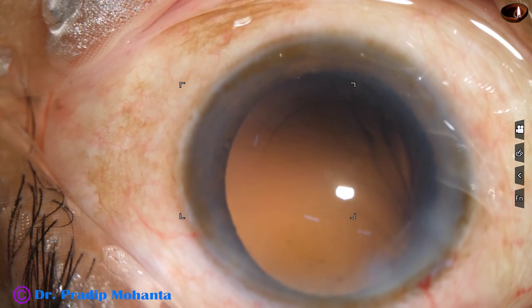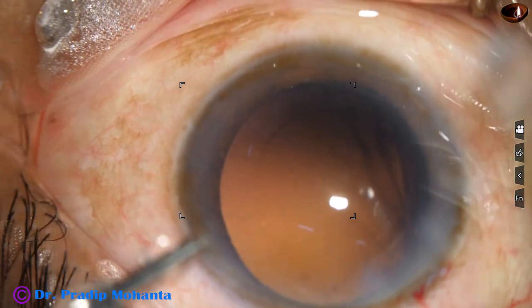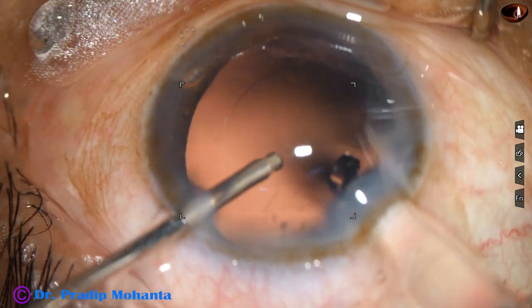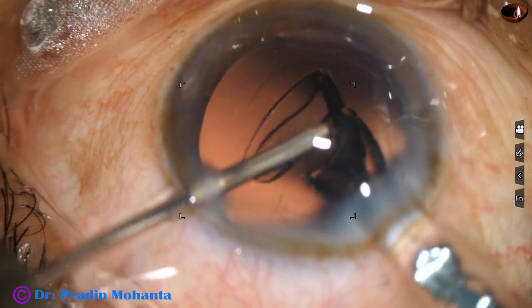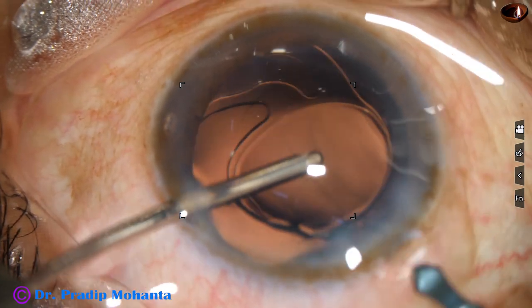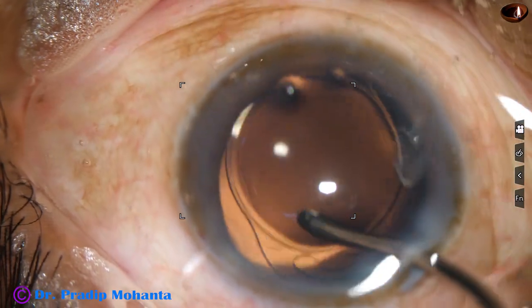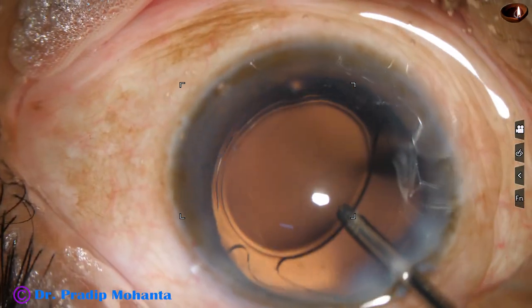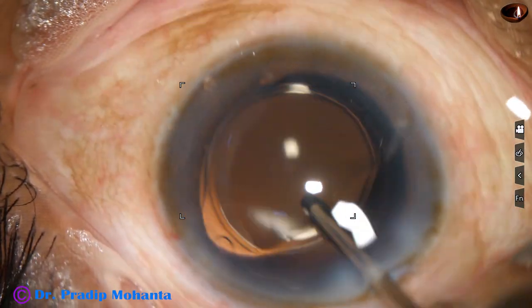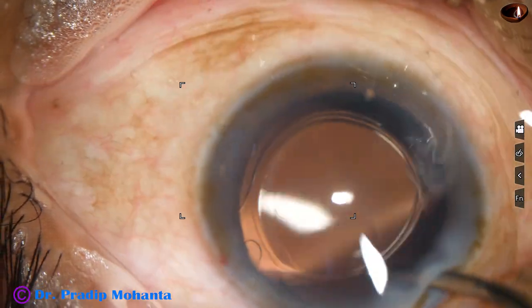Now it is the time to implant an intraocular lens. This is a single piece monofocal intraocular lens. Here it goes. The anterior chamber is maintained by irrigation, so we do not need any viscoelastic, and the time it takes to remove the visco is saved.